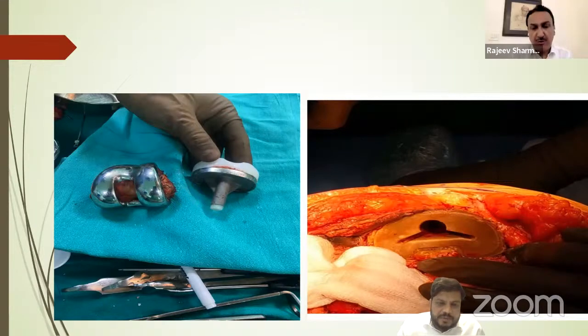So Dr. Gaurav, before we go ahead with what you did, let us give the message to our viewers. A very important thing that you mentioned in this case is that an unstable TKR may result in an easy injury and a fracture. Osteoporotic bone has to be managed well. As Shubhranshu rightly mentioned, it is better to take care that these patients have stable joints, and if needed, an extension stem is used. And thirdly, on cementing, it is not enough that you just put the cement. The cement has to have a good bonding with the bone and the implant.